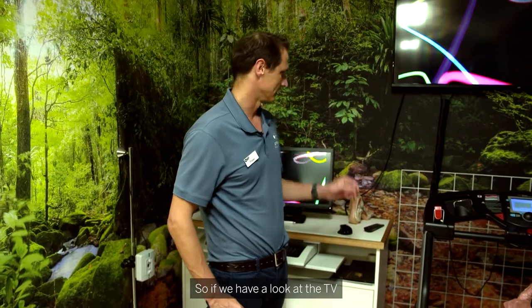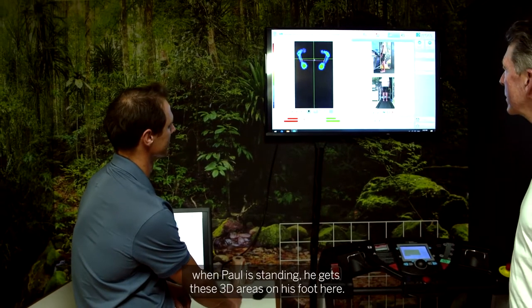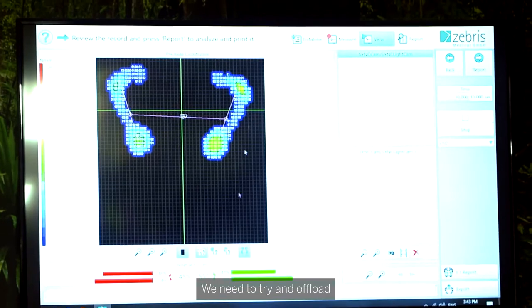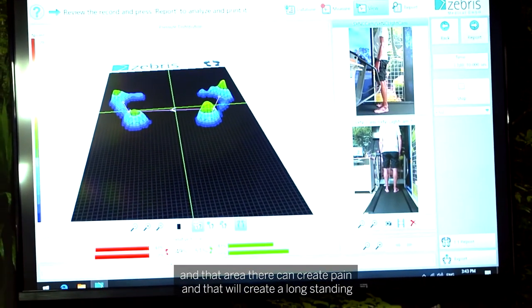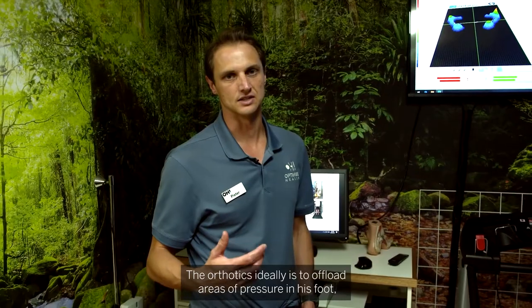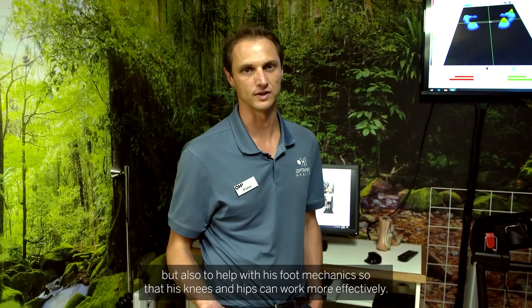If we have a look at the TV screen here, you'll be able to tell that when Paul's standing he gets these red areas on his foot. We need to try and offload a few of these areas, because otherwise he gets a corn or a callus, and that area can create pain and a long-standing injury. The orthotics ideally offload areas of pressure on his foot but also help with his foot mechanics so that his knee and hip can work more effectively.